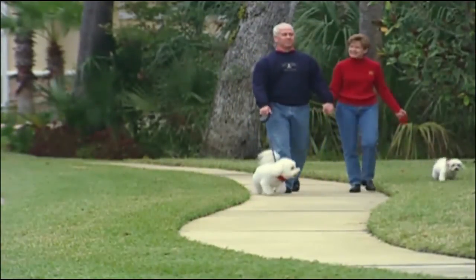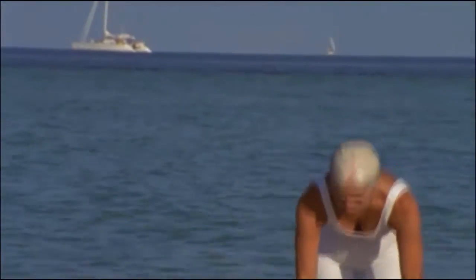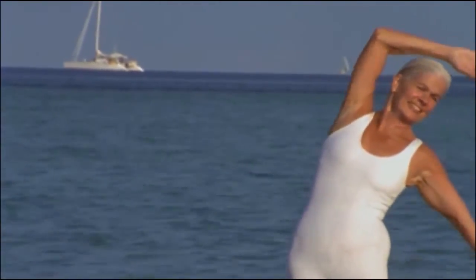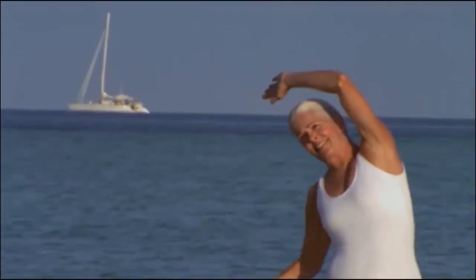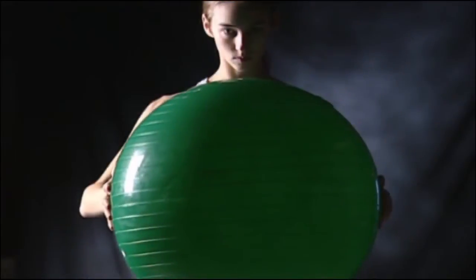If the costovertebral block relieved your pain, then the suspected joint was indeed the source of the pain. If the block did not relieve your pain, the process may be repeated at a different joint to help determine the source of the problem.